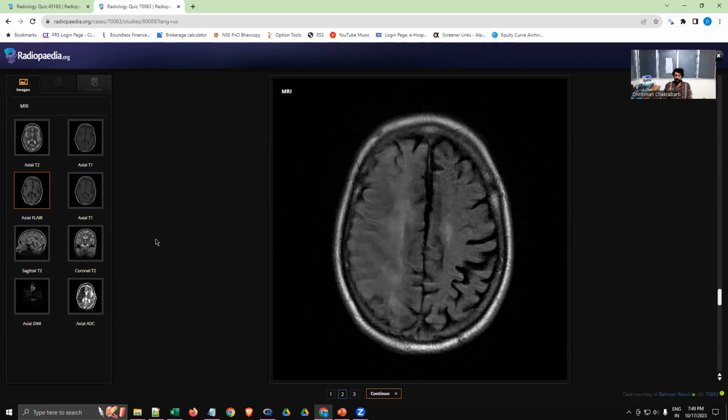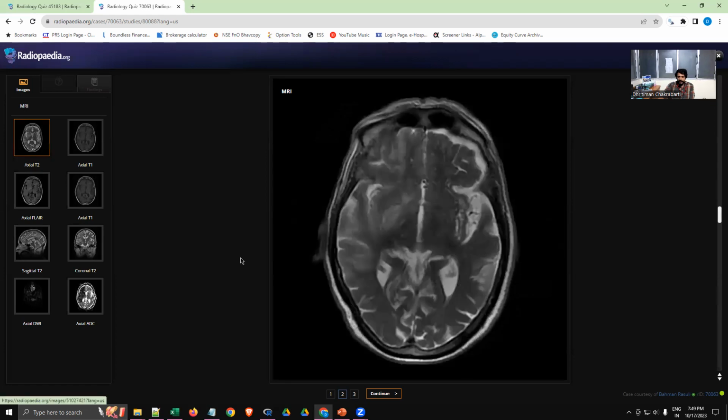In acute stroke, you will have the DWI being bright white, ADC being deep black. In the middle zone, you will have DWI which is still bright white, but the ADC is a little less black. So that is how the MRI images in stroke evolve over time. Now let's just look at this one. This one is a case of acute stroke.